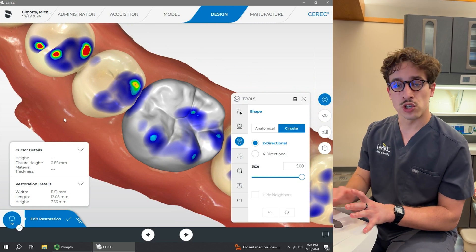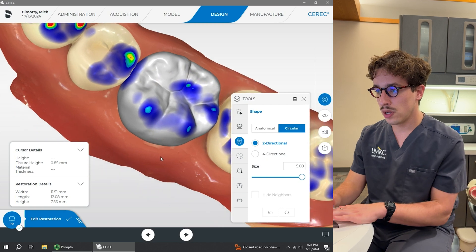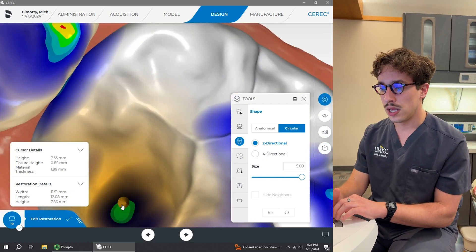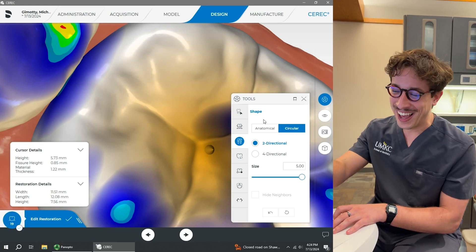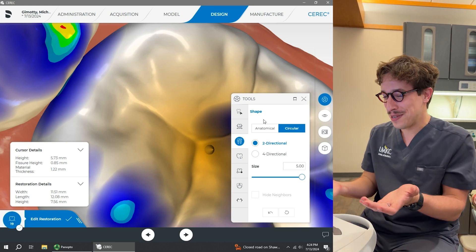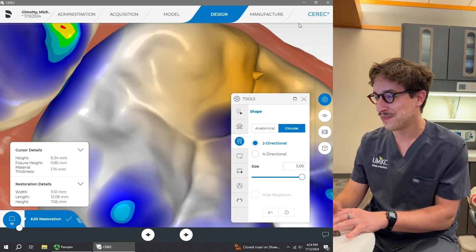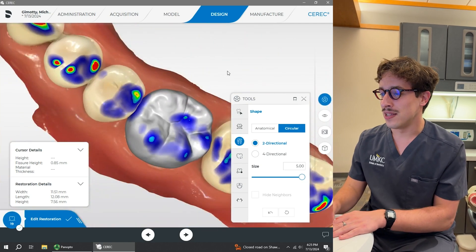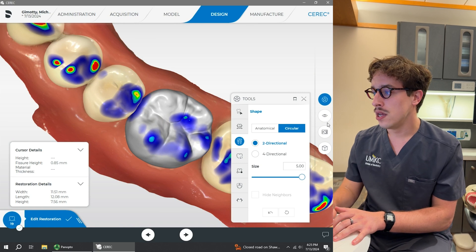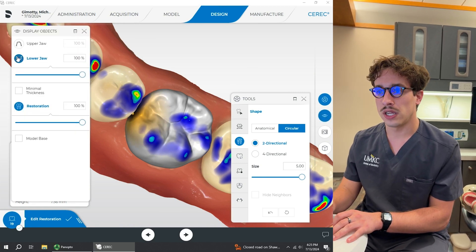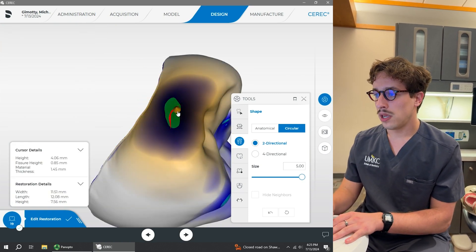I'm going to raise this marginal ridge just a tiny bit right here. Now I'm going to check the contacts — for contacts you want that lightest blue, the lightest blue portion in the middle of this lower area. What we'd like is to have that with maybe a little bit of green on the contacts. So I'm going to hide the lower jaw so we're just looking at this. I'm going to bring this out just a little bit more.